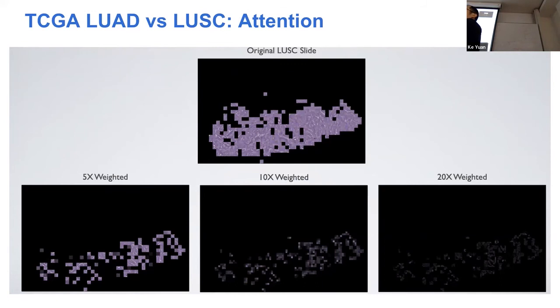So your representation from the CRC data set was translated here? You used the representation you learned from the CRC data set? CRC, the colon. No, we didn't use any transfer learning. We trained de novo from the lung cancer data set and got this. So the question that comes to mind is, how would it compare to standard ResNet features representation for the same patches?